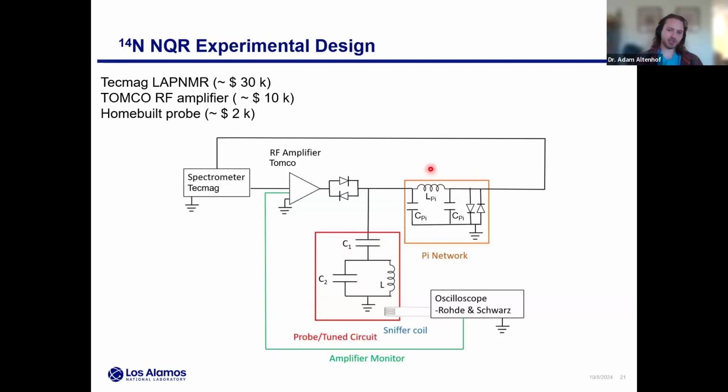And something interesting that we use is, for our passive transmit receive switch, lambda over 4 cable at these frequencies is going to be something like hundreds of meters. So we don't really want to use that. Instead, we can use this thing called the Pi network. This is really nice. It's just a lumped element circuit, totally passive. And it gives the exact same effect as the lambda over 4 cable, assuming you set these values to be tuned for the resonance that you're working at.